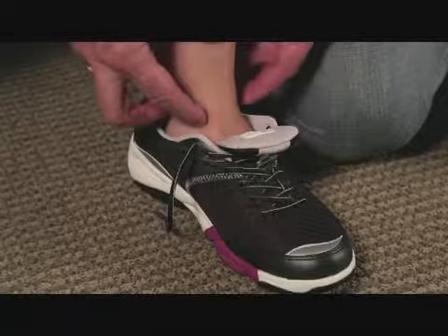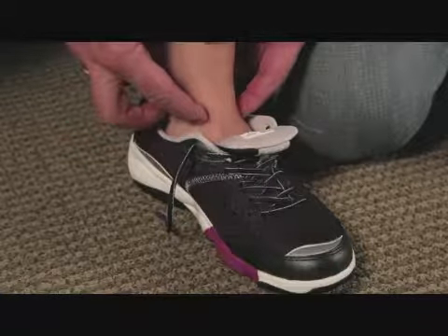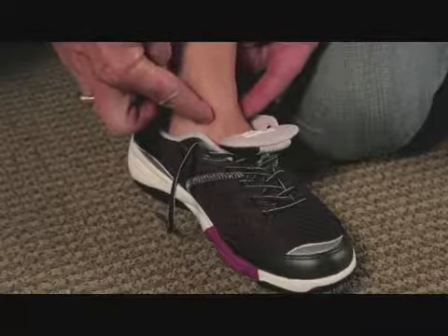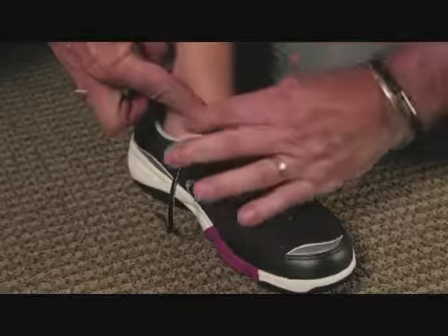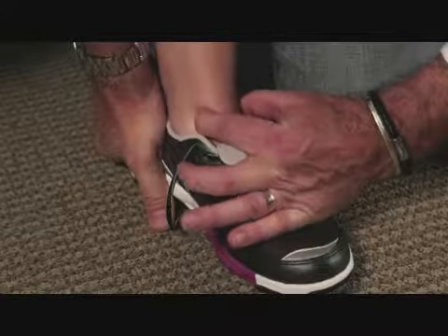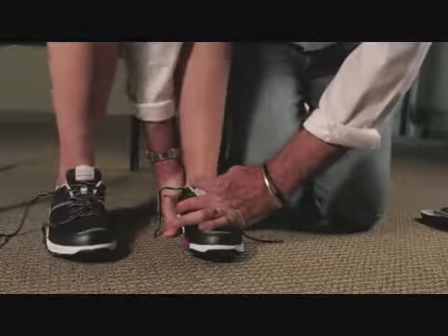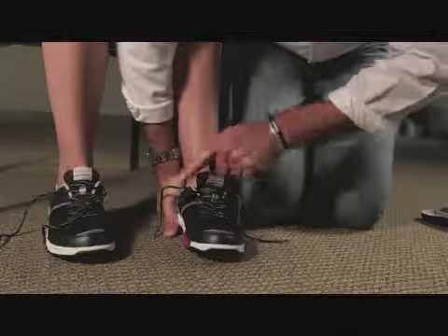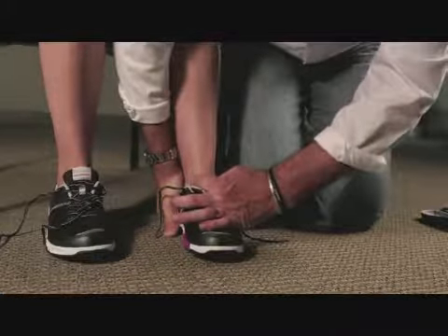Now we're going to place the patient's subtalar neutral position here. We're going to come around the leg, cup the heel to support the foot, and we're going to ask our patient to stand. This is a controlled position, so we make sure that the patient doesn't pronate into the orthotic — we maintain neutral.